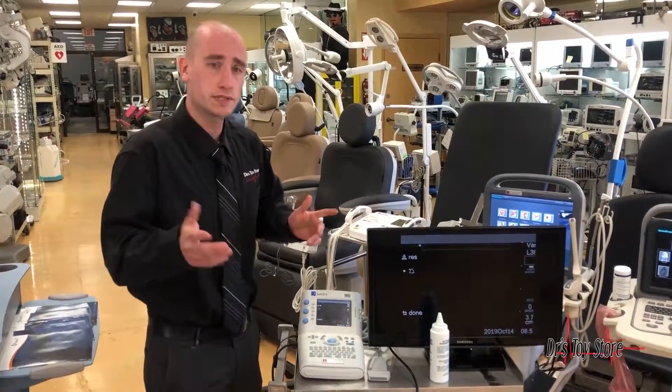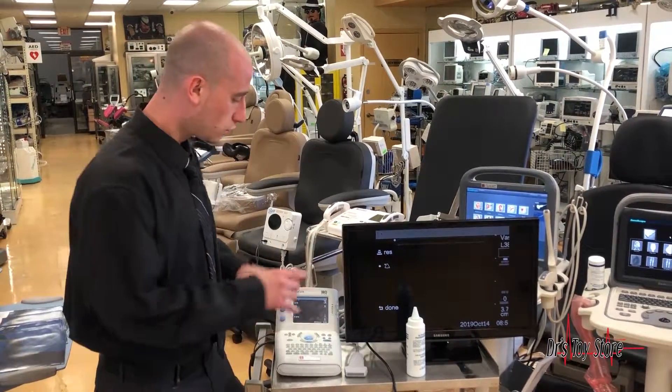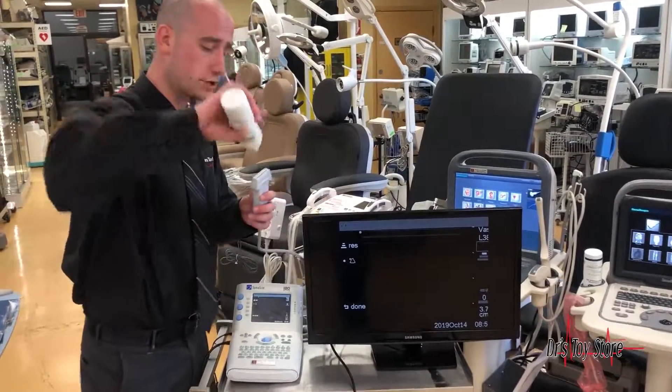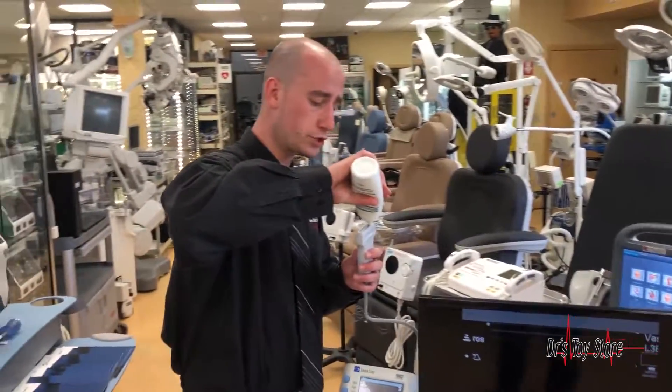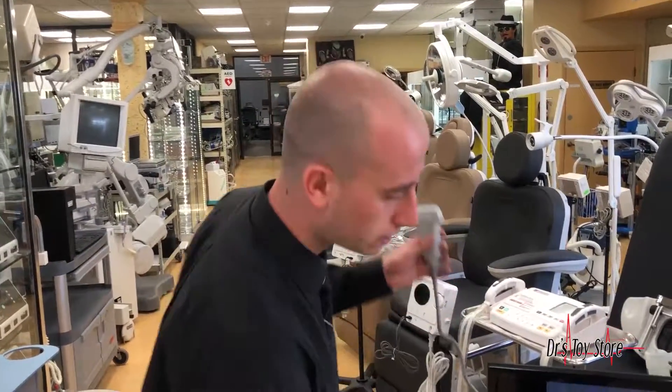Now the only problem with the system is that it has a very small screen, and a lot of portable systems do have small screens. What you can do is actually plug it into a monitor and display the image on a monitor so you can see better what you're doing and show the patient what they look like, what their baby's looking like, all of that.